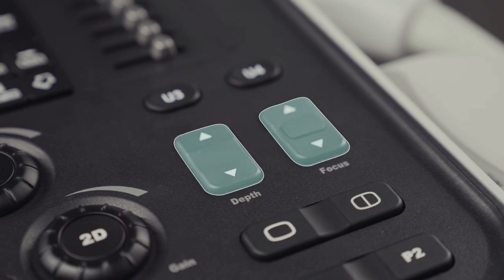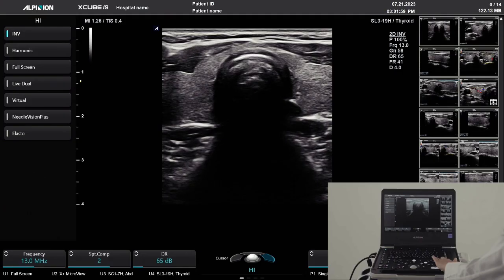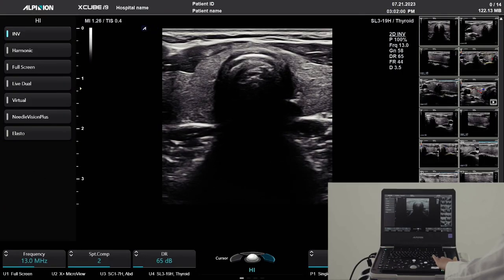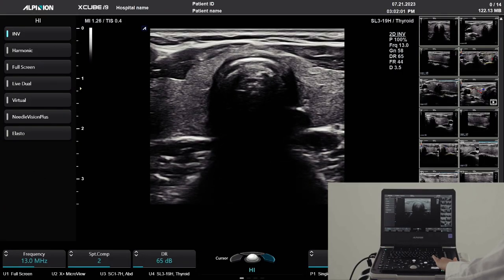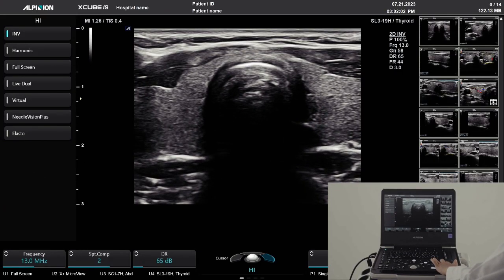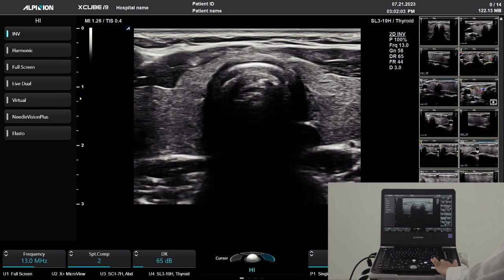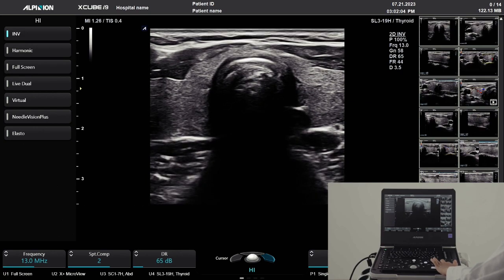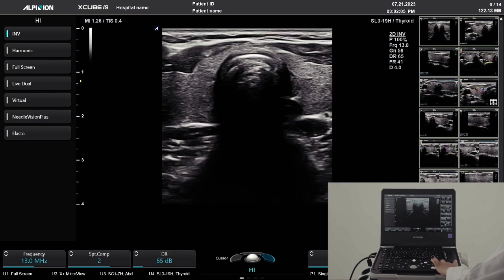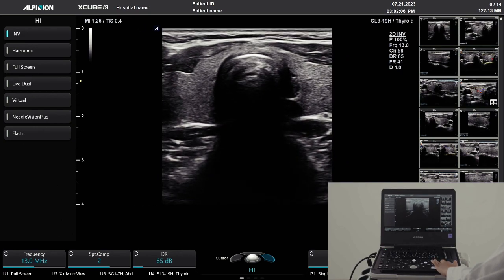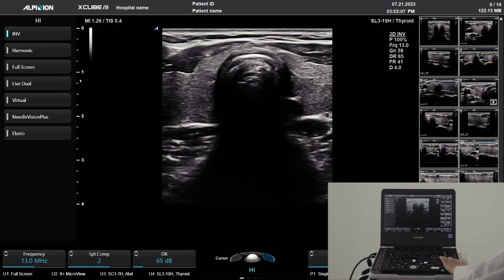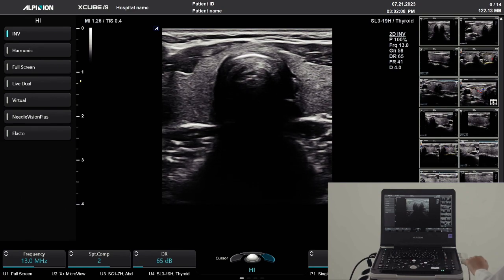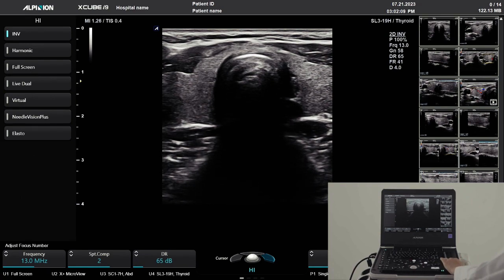Depth and focus. You will adjust depth with every exam. Press the up arrow to go to a shallower image, and the down arrow to display greater depth in the body.